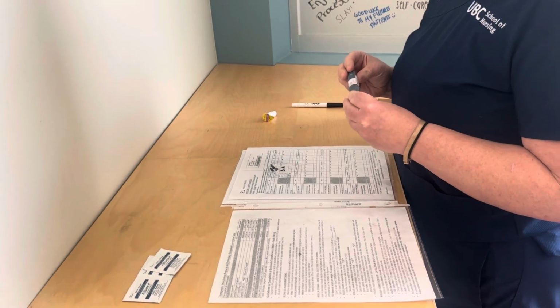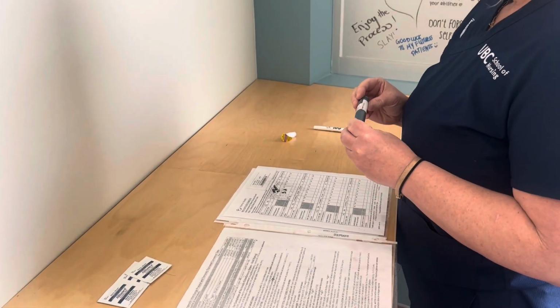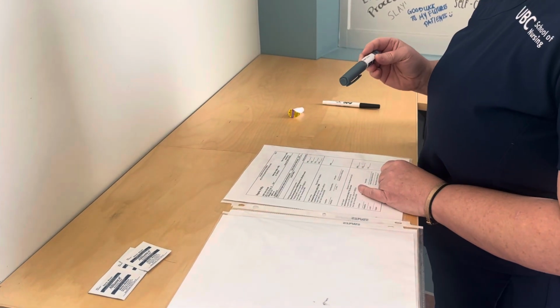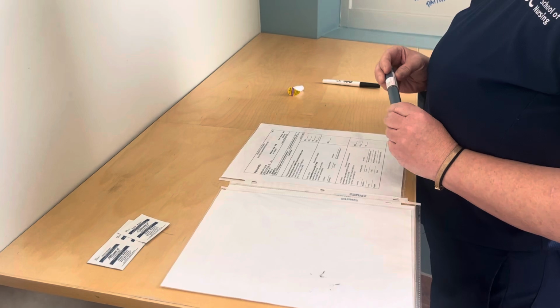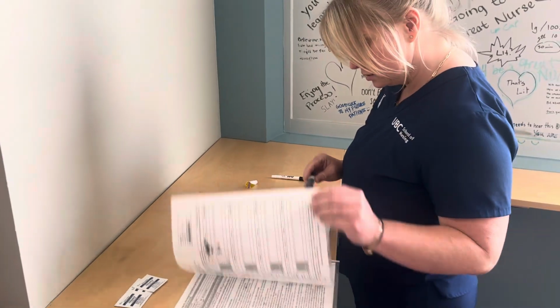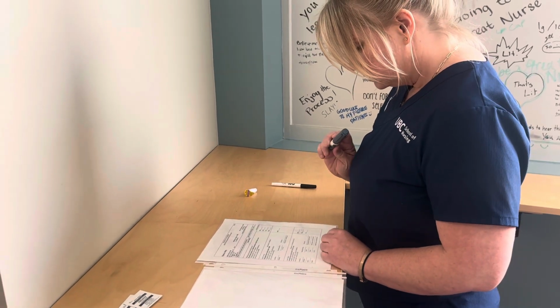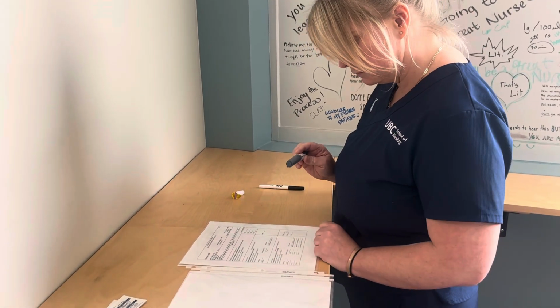So I've got the right patient, Polydipsia. We've got the right drug, aspart, at 100 units per mil. The right route is sub-Q. The right dose, we've already calculated the dose at 3 units. And the right time, 12:30.